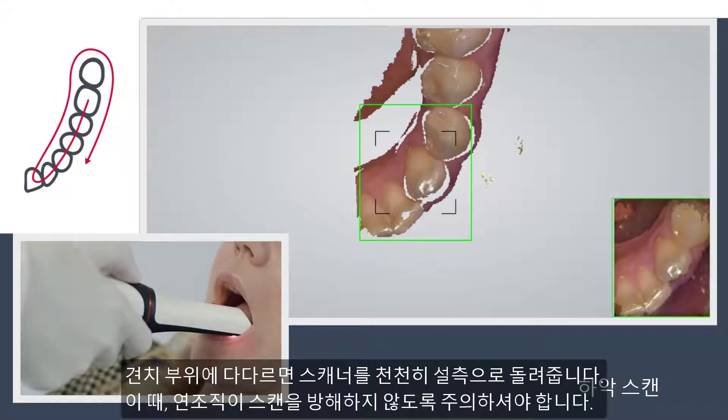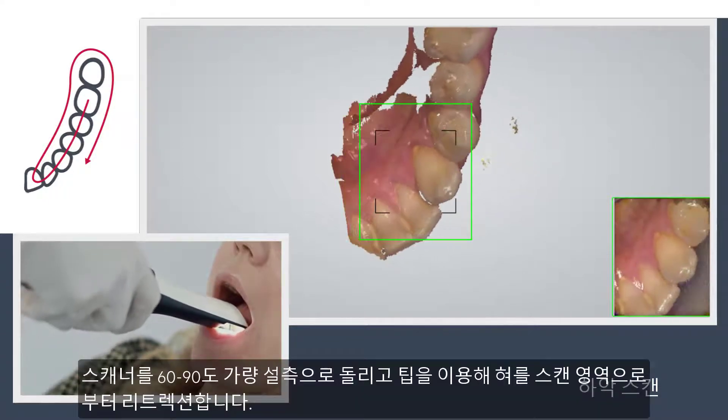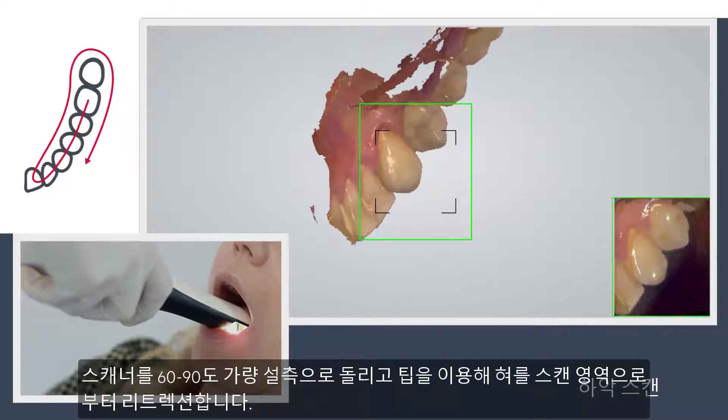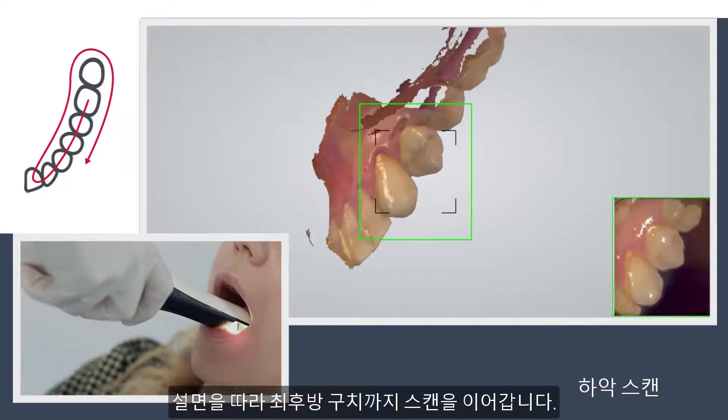When you reach the K9, turn slowly lingual, taking care first of areas where soft tissue may interfere with the scan. Roll the scanner 60 to 90 degrees to the lingual side. Use the tip to keep the tongue away, and go along the lingual surface until you reach the last molar.